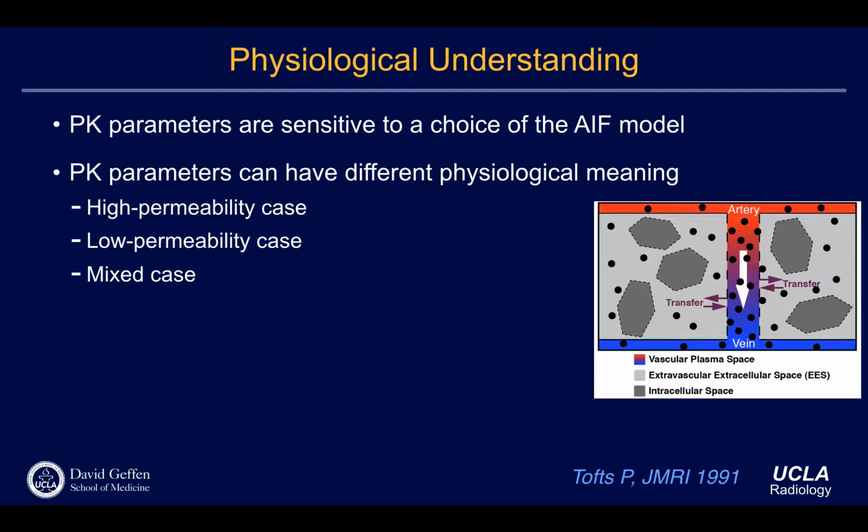Because normal tissue is not going to be that leaky, it's going to have some permeability issues too. So in a normal situation, it's a more mixed situation. In a tumor situation, it's going to be high permeability, and K-trans is showing more perfusion. That's why people call K-trans imaging a perfusion imaging, because in a tumor, with high permeability, K-trans is fully representing tumor perfusion. Any questions?